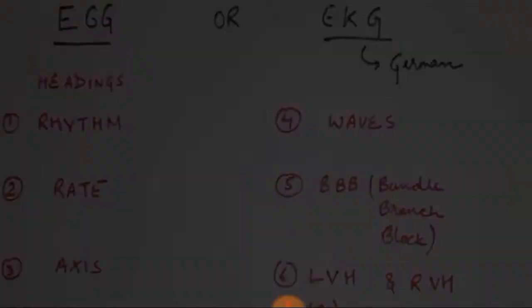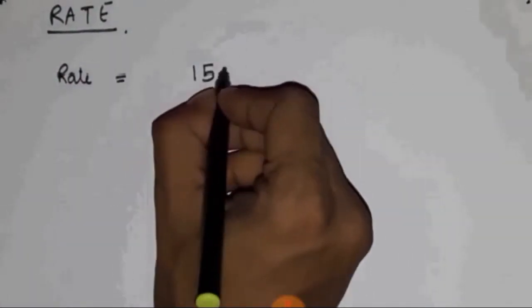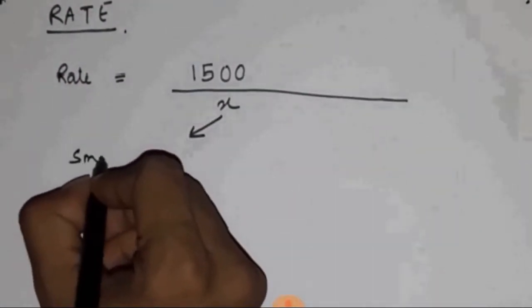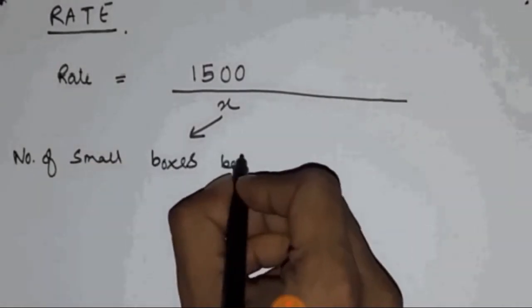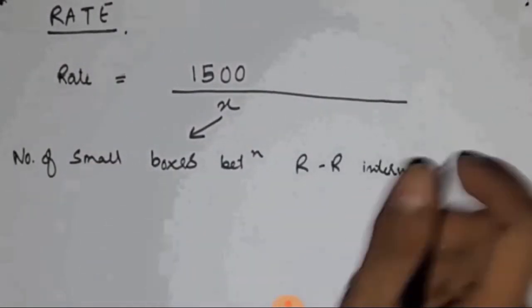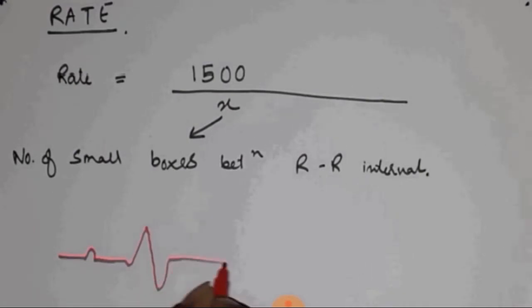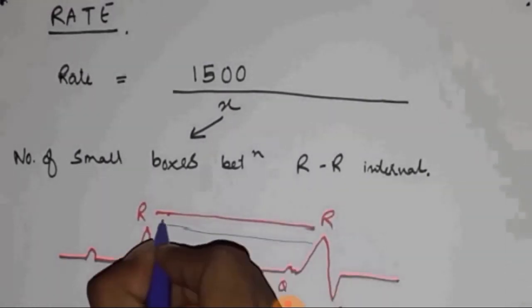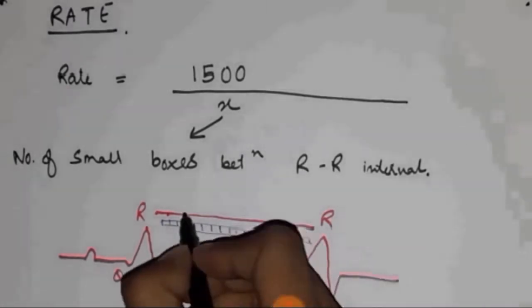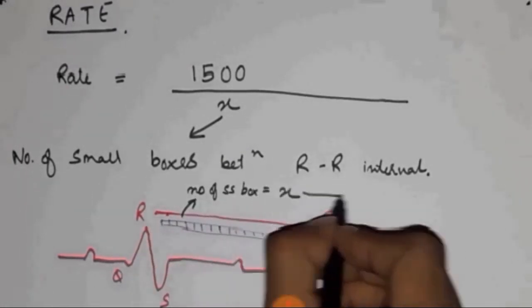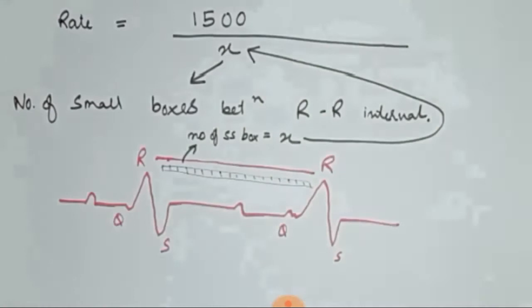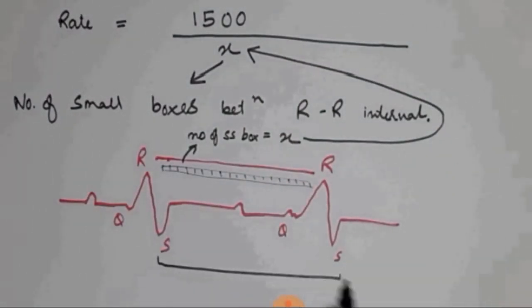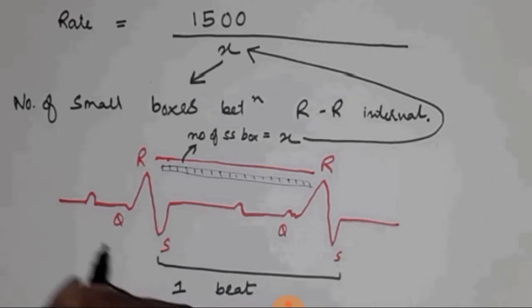Let's look at the rate first, how to calculate. This is given by the formula 1500 by X, referring to the number of small boxes between the R-R interval. Here we have the ECG curve. I am marking them as QRS. The R-R interval, we are going to count a small number of boxes, which is the X, and putting that into the formula. We take the R-R interval because it refers to one beat, or one heartbeat, or one cardiac cycle, or lub-dub.